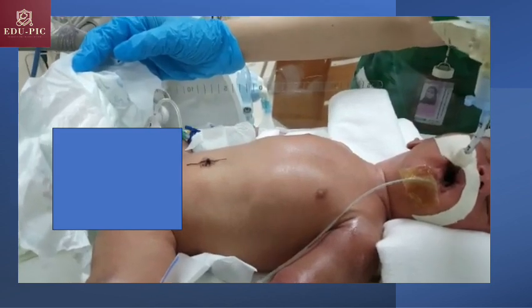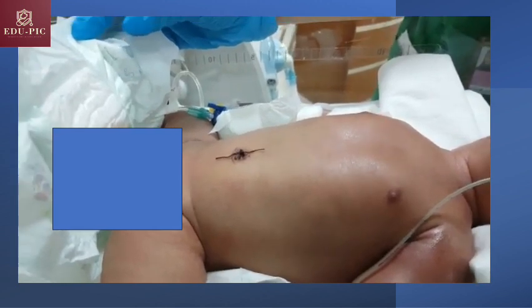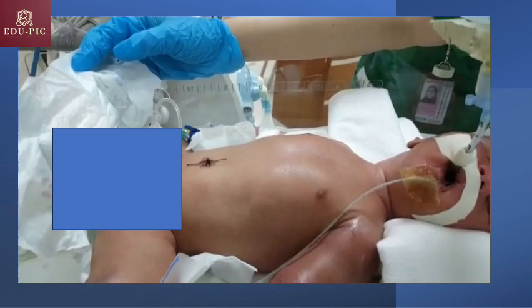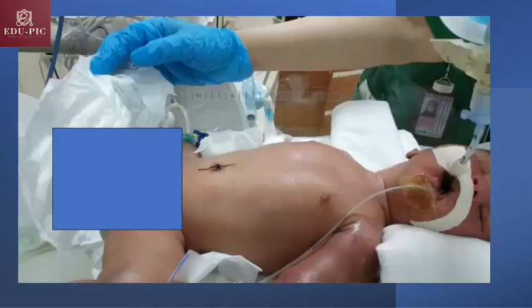And here in this video you can see the chest wiggles. You can focus on the umbilicus and you can see how fine these vibrations or chest wiggles are. You can accept wiggling up to the groin, but not up to the toes or the head. This is too much wiggle. If you reach the head or the toes, that means you are giving high amplitude and you need to decrease it. But we usually target the umbilicus and we can accept up to the groin.